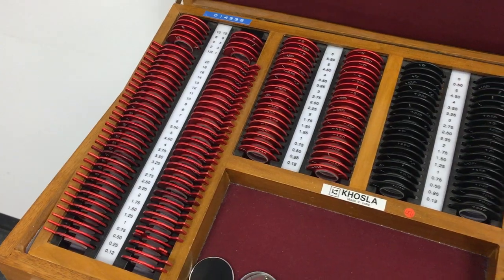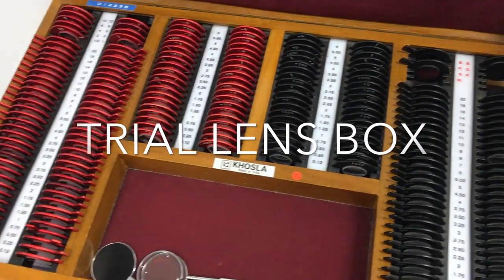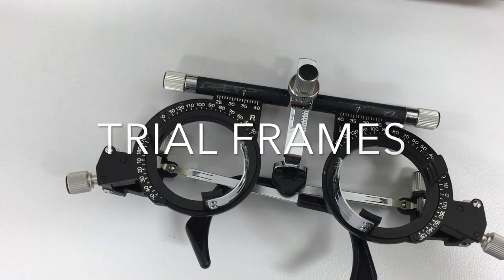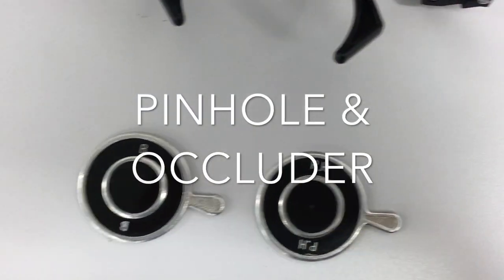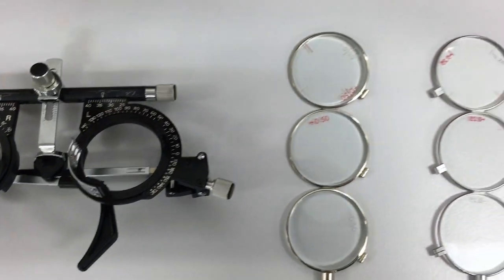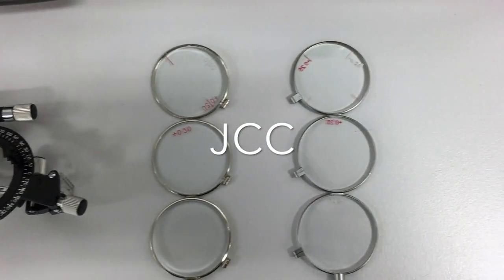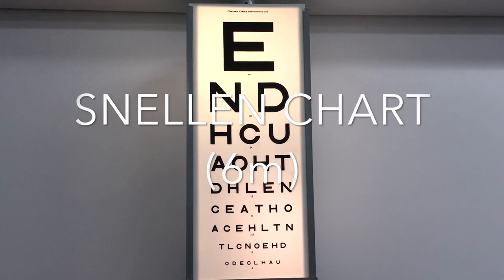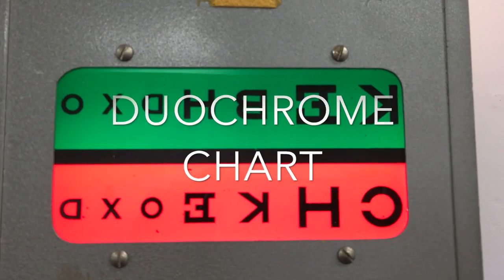The equipment needed are a lens box, trial frames, pinhole and occluder, and Jackson cross cylinders. You will also need a vision chart — in this case we've used a Snellen and a duochrome chart.